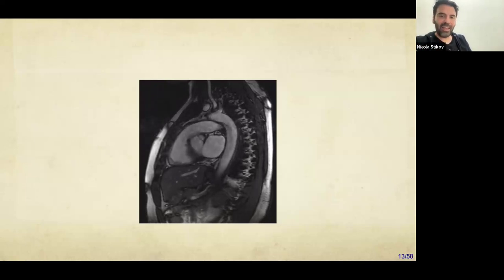So what you're seeing is not technically a single heartbeat. It's an average over many heartbeats, but always acquired at the exact same time, in which case it appears to be a single heartbeat. So it's a trick. You can imagine that unless the heartbeat is regular, it's not going to work. But most of the time, heartbeat is regular, and that's how we manage to make those images. So usually we use them to see how much the ventricles expand or contract, and that kind of thing is independent of the regularity of the heartbeat. Any other questions?